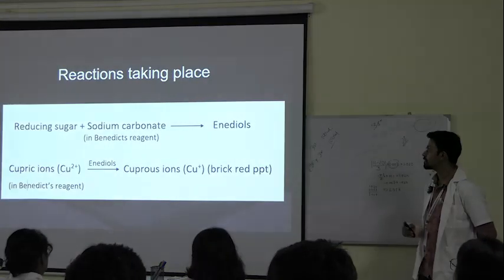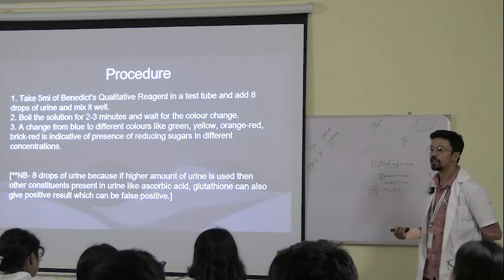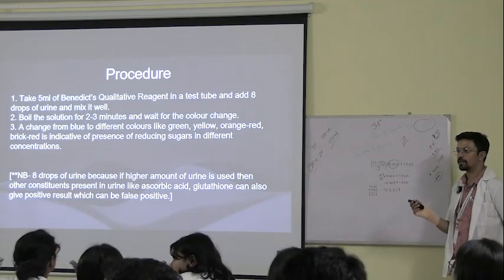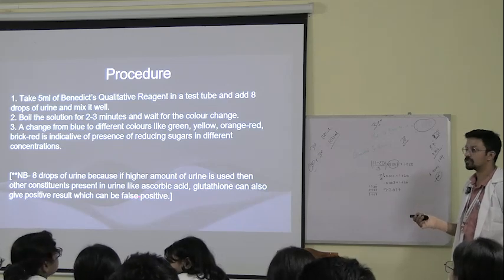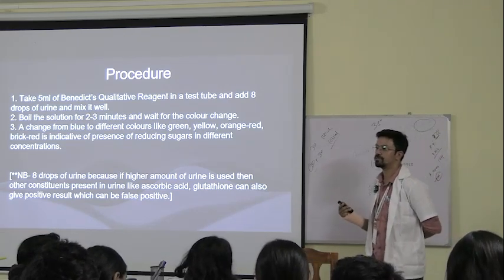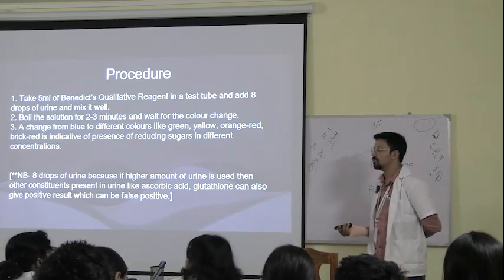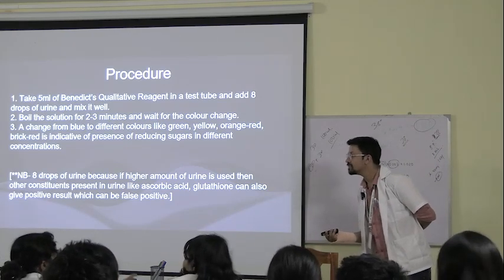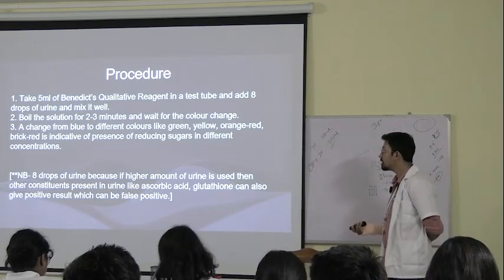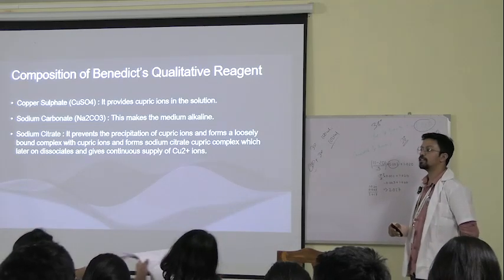This one is nothing over there. This one, the procedure is also easy. 8 drops. What are the products? And another one I mentioned with my mouth; I did not write it. Homogentisic acid, HGA. Composition. Anybody has any doubts from here?